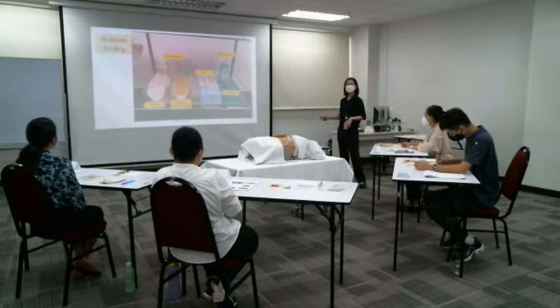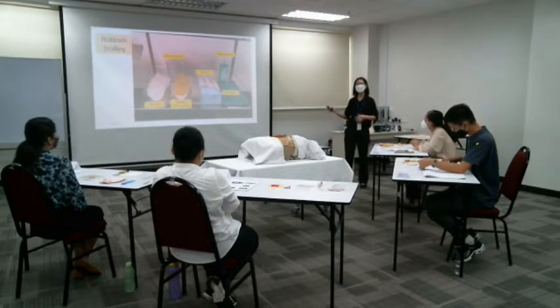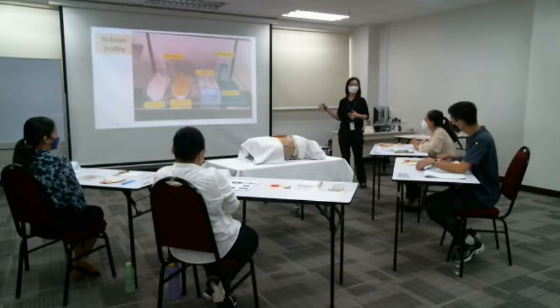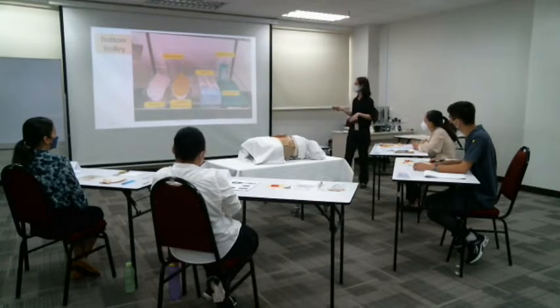Hand sanitizer. So in between, we need to sanitize my hand. So can you tell me this is a sterile procedure or a non-sterile procedure? A non-sterile procedure. Okay, so the cleaning method is to clean the stoma, clean the peristoma skin. So clean the stoma, pick up the feces, clean it nicely so that it won't smear everywhere. Clean it correctly in the way that it is clean, okay, after the process of cleaning. And you do not need to follow any sterile technique. It's not a sterile procedure.